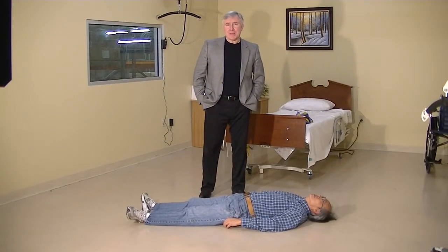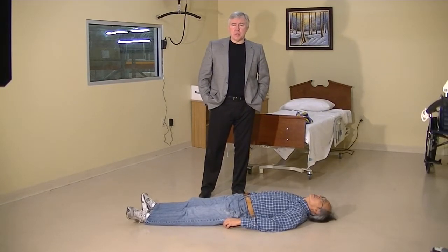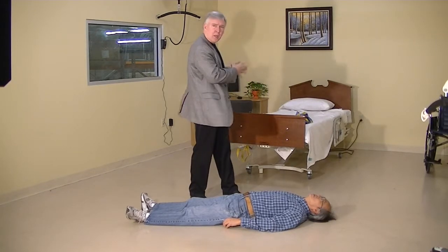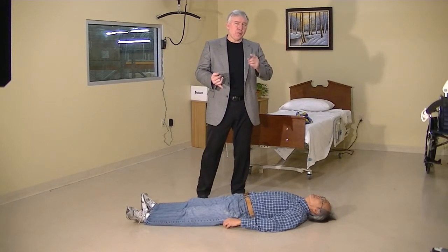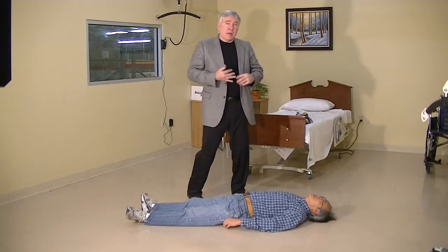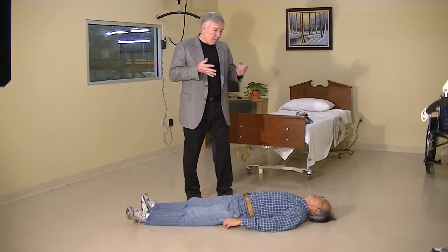Okay folks, Damian here again with Best Care to continue my demonstration and training on the use of the Goulman Leepco compatible sling. I've shown some training already on how to lift a person from the chair and how to lift a person from the bed. But now I'm going to show how to transfer patients on the floor.